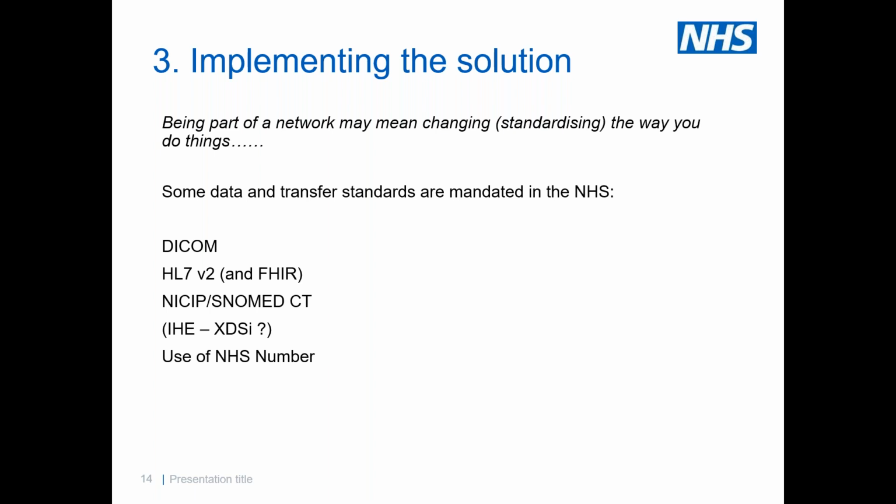The use of IHE and XDS-I is a little bit more controversial and certainly is not mandated at this point. But it may well be the way we go in the future. It's something that we're looking at, thinking about. Use of the NHS number, as I'm sure you're all aware, that already is mandated in the NHS, in England certainly.